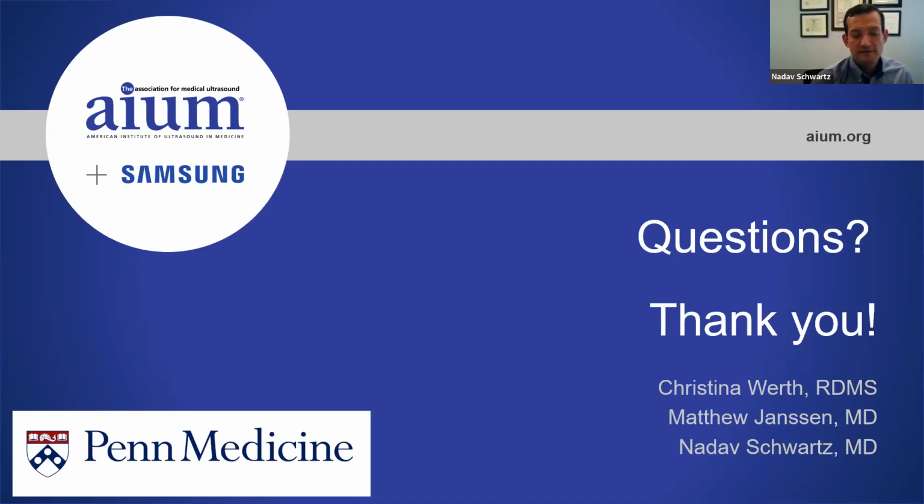Sure. I think it's a very fair question. We're trying to make the argument here about the utility of the 3-vessel view, and we wouldn't want to be saying anything that is different from the guidelines. The outflow tracts still are super important, and your goal, whether you're learning your craft or trying to incorporate fetal cardiac imaging into your tool set, I think the outflow tracts are obviously very critical.